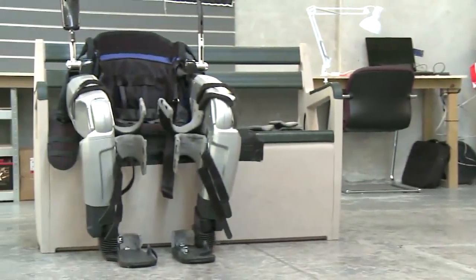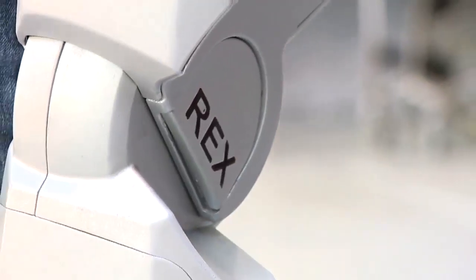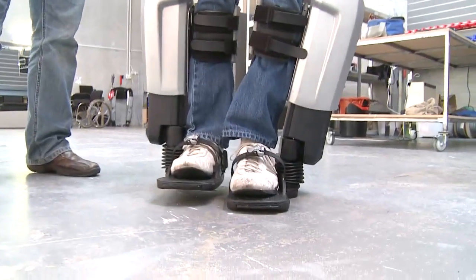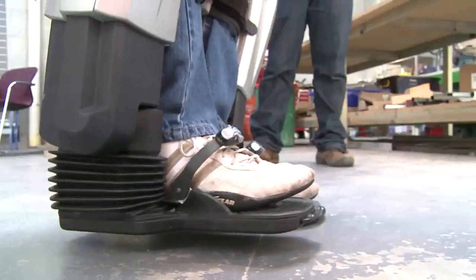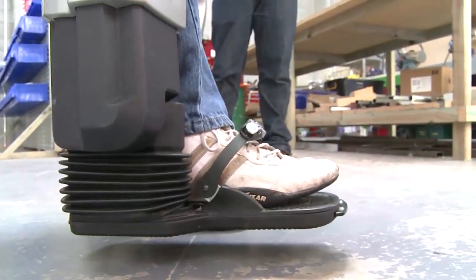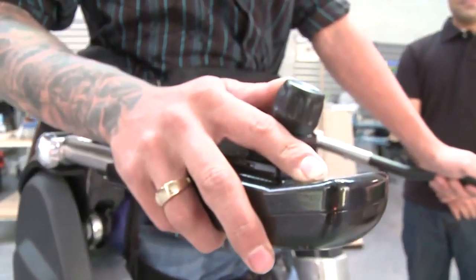I find the Rex legs are really easy to use in a sense. It took us about three days to get myself fitted properly and end up walking around. From someone that hasn't walked for five years, I would have expected it to have taken longer, but it didn't. And then once you know the functionality and the movement of the actual legs, it becomes extremely easy.